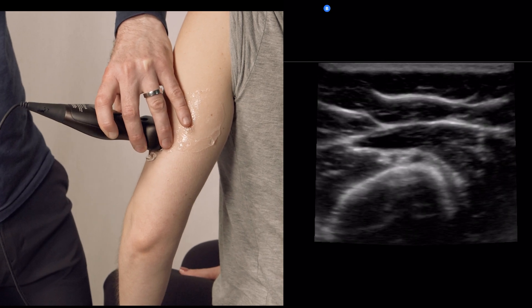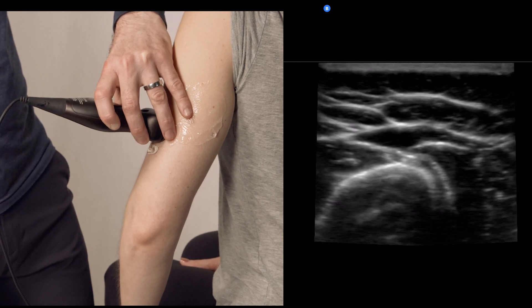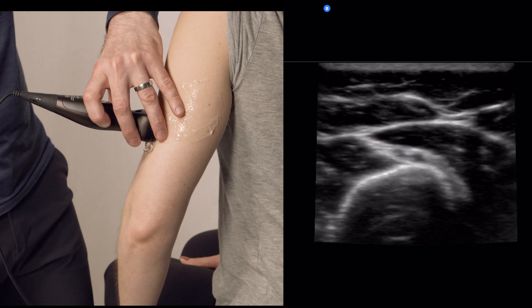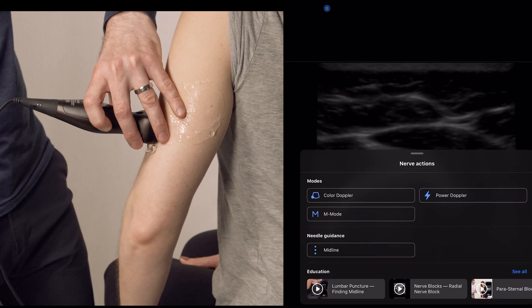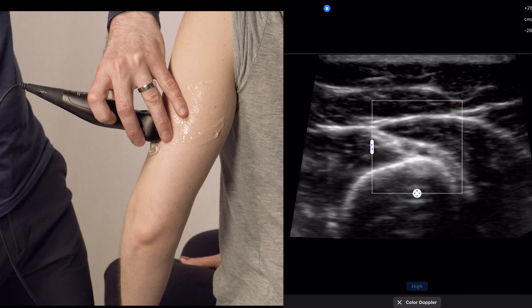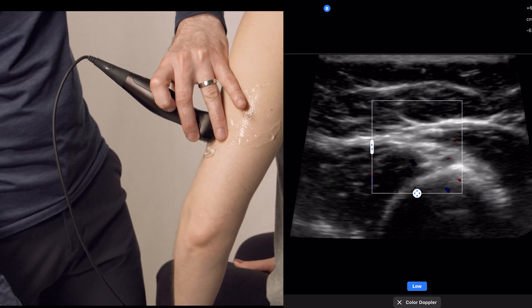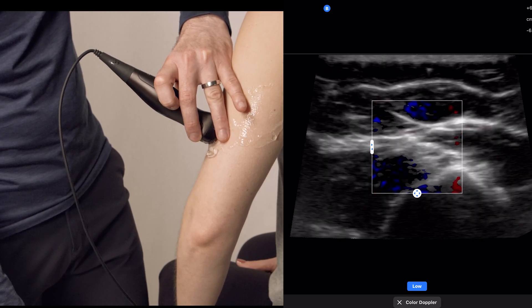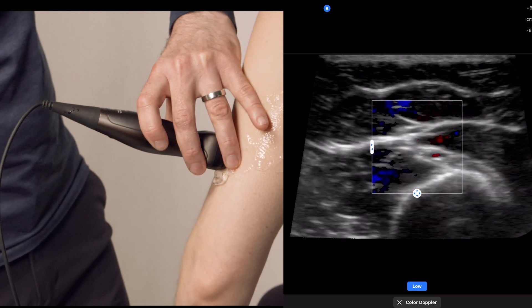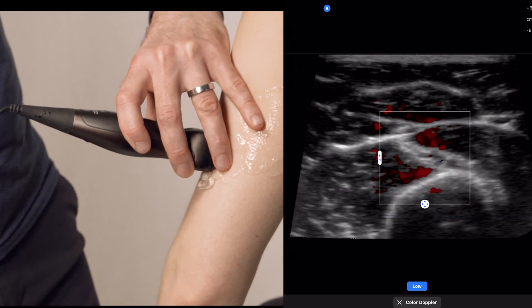Here we have an artery and a nerve. It's always very helpful to look at these structures and use your Doppler — turn on your color Doppler. Sometimes you need a low flow setting to get some of these nerves to pop out. If you compress them too hard, you can even compress the flow in the arteries themselves.